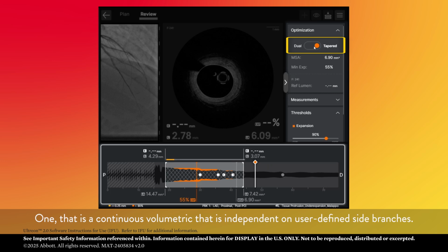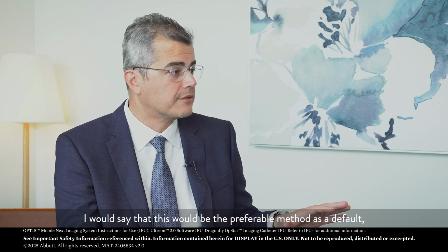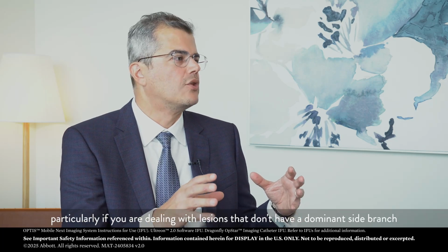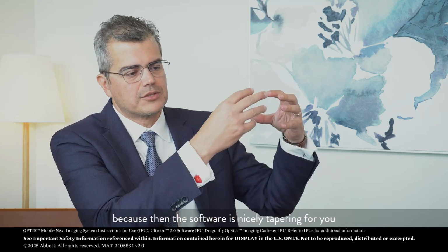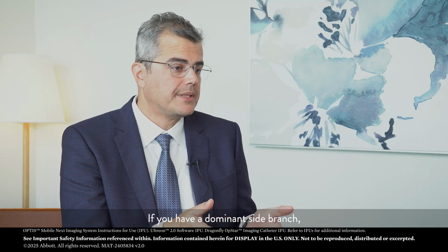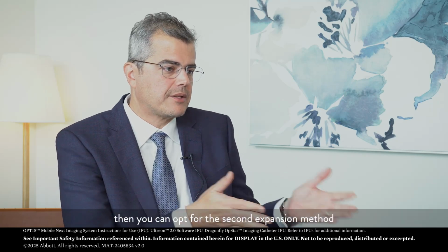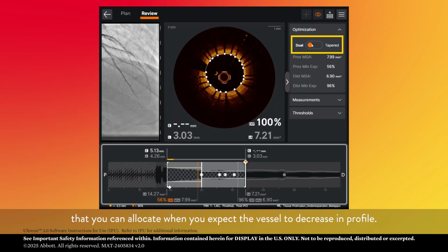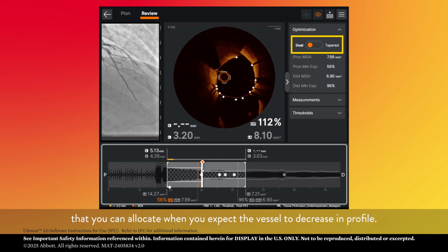user-defined side branches. I would say that this would be the preferable method as a default, particularly if you are dealing with lesions that don't have a dominant side branch, because then the software is nicely tapering for you how the vessel should be. If you have a dominant side branch, then you can opt for the second expansion method, where you can allocate where you expect the vessel to decrease in profile.